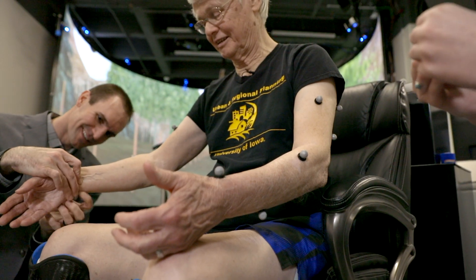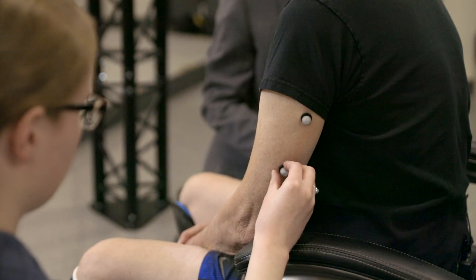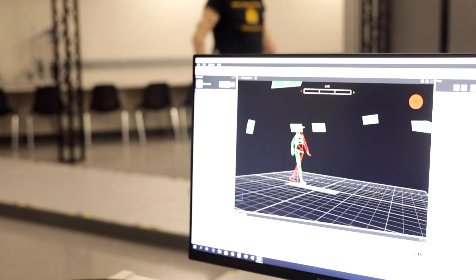In total, we put 57 markers on our participants, and that allows us to track the 3D motion of all the different segments of his body. For example, you have three markers on his upper arm, and that allows us to very precisely track his arm as it moves through space.